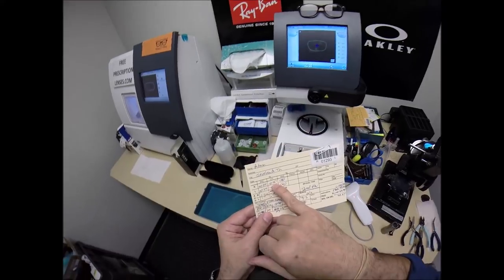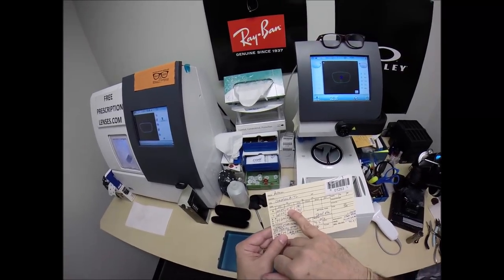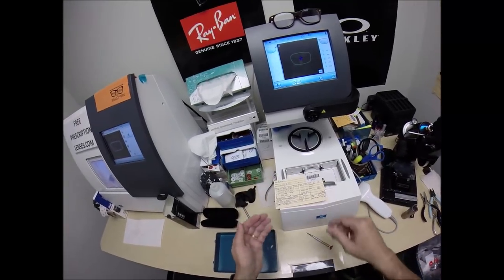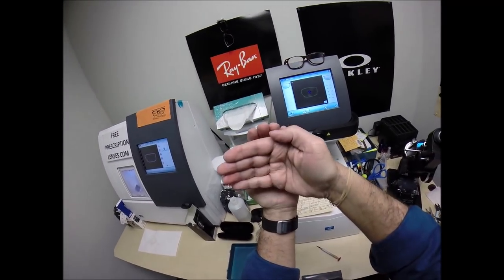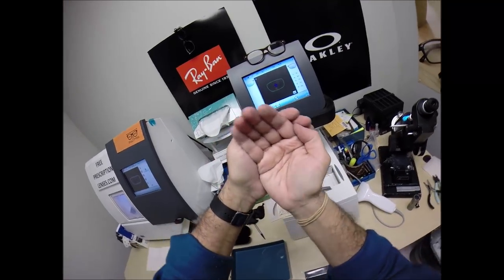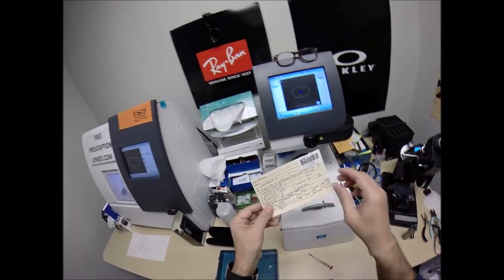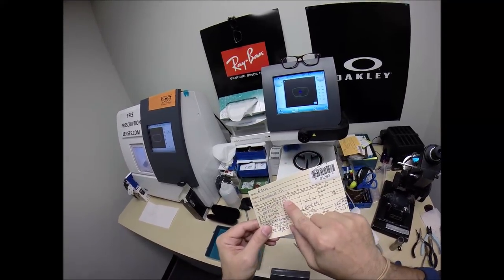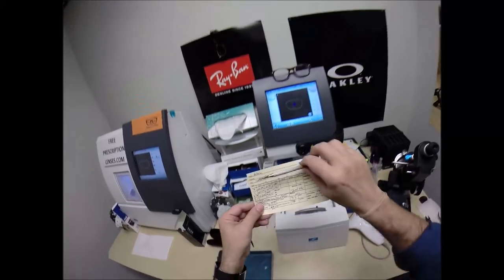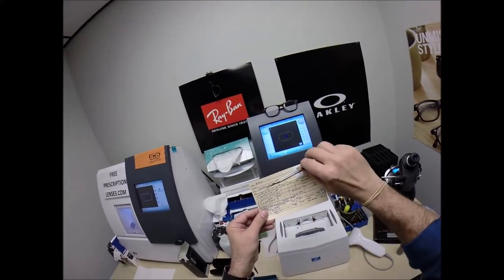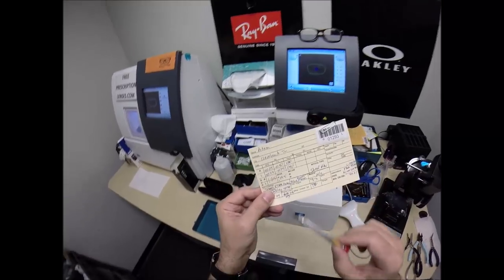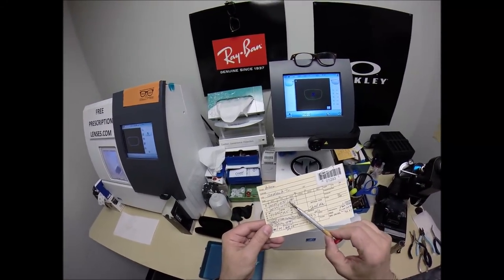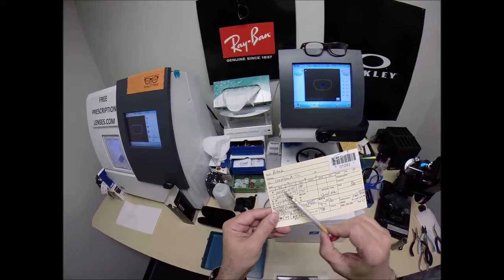Now most of your prescription is astigmatic. Meaning that you need astigmatism correction. You have two curves on your eyes. A nearsighted curve this way. An astigmatic curve this way. And that's how you line up those two curves to make everything nice and crisp. So you have an additional two steps of astigmatism correction at the 80th meridian. A straight line is 0 to 90 to 180. We're going to turn that fine-tuned knob. And uncorrected astigmatism makes 6s and 8s look alike, or the letters P and F.